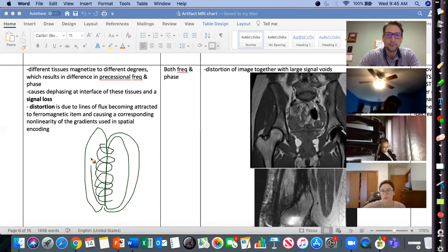It's equal on both sides. Not the best drawing, obviously, but you want these magnetic flux lines to be very symmetrical, like elephant ears, and they get larger as they go out.